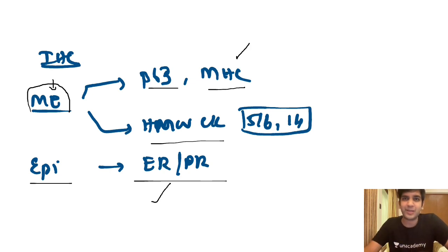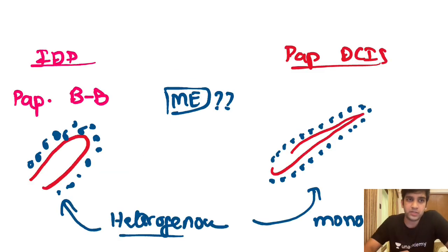Not just say, okay, I have some doubt of carcinoma, so do everything like CK, vimentin, Ki-67 and everything. No. I need to know the histomorphology, and then I'm going to say use the markers. I know what I'm going to see. With that permutation and combination, I'll say this is the possible diagnosis, right? So now look at each of the six entities: the microscopy, histopathology and my IHC as well. Before that, we need to understand a few terms. The first thing I'm going to compare is intraductal papilloma and my papillary DCIS, right?